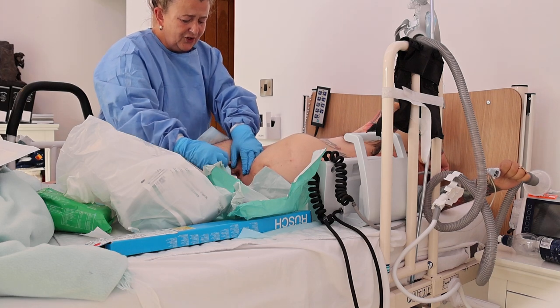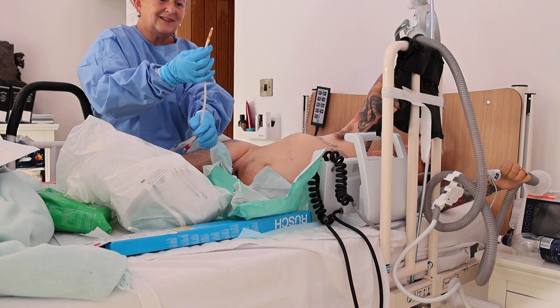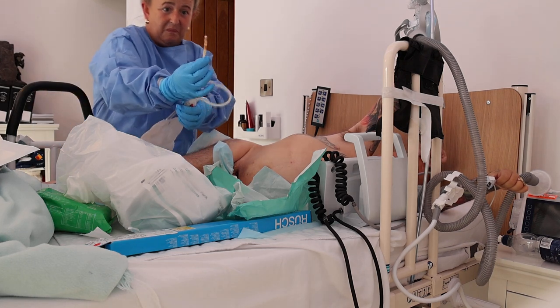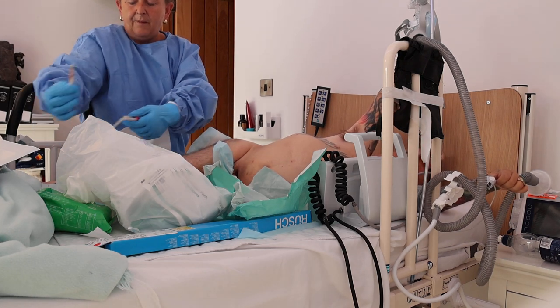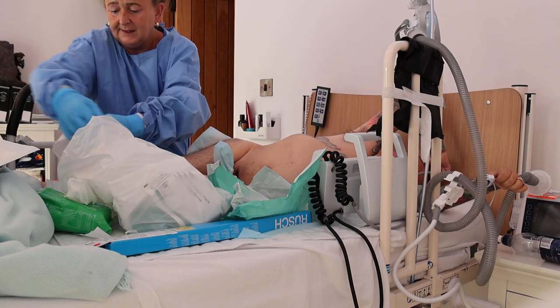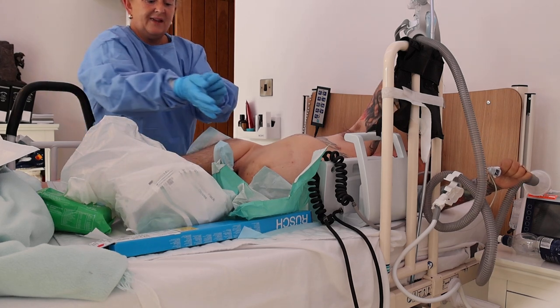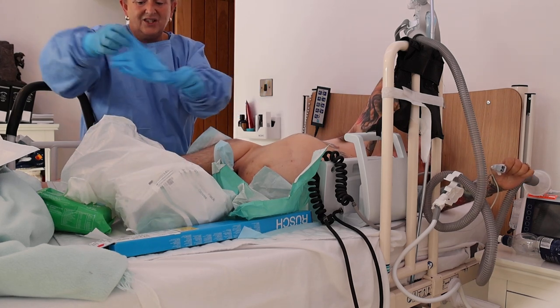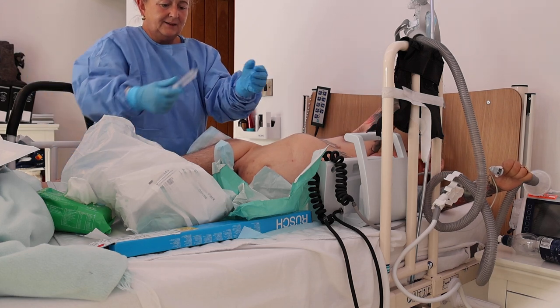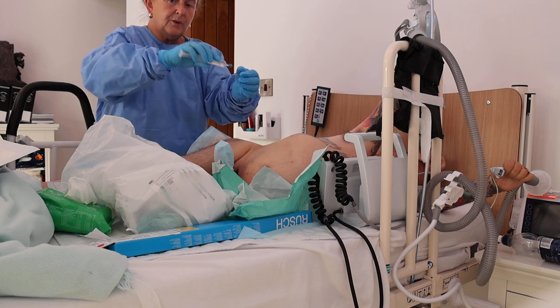Oh, God. I knew I smelt infection. Look at the state of that. That it's infected, look. I could smell it with him this morning, and I told him straight. How blocked that is. So all that, I'll just get that sterilised glove off quick, my dirty one. And because I've still got a clean hand, I'll use this now, take the cap off with my clean hand.